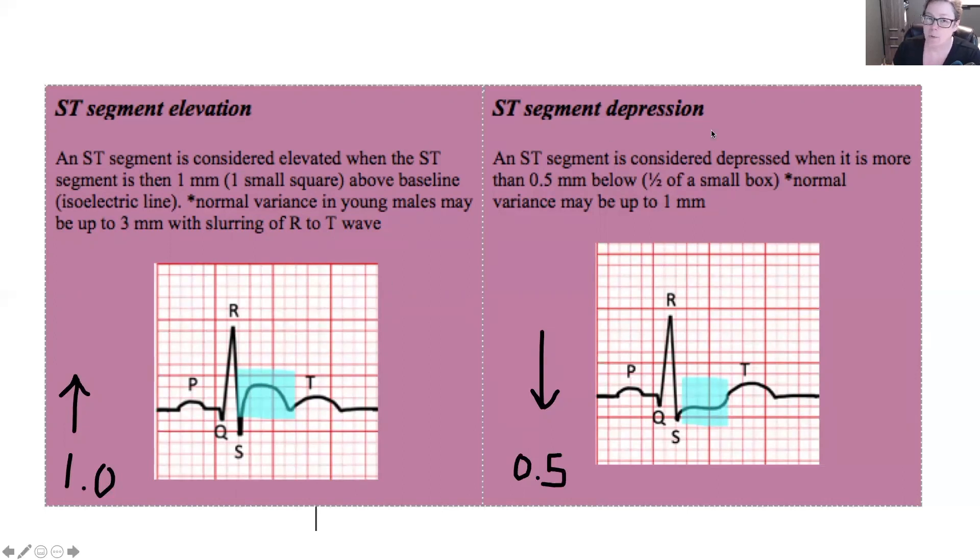ST segment depression is when the ST segment goes below isoelectric or baseline. And so here we have our isoelectric line, and you're like, well, I expect to see it right here, but it's not there. In fact, it's below. So it doesn't have to even go below as far as the elevation. It only has to go below 0.5 of a millimeter, which is half of a small box. That's it. So this line is pretty sensitive, and it's a great indicator. It tells us whether or not we have injury and insult in the myocardial tissues.